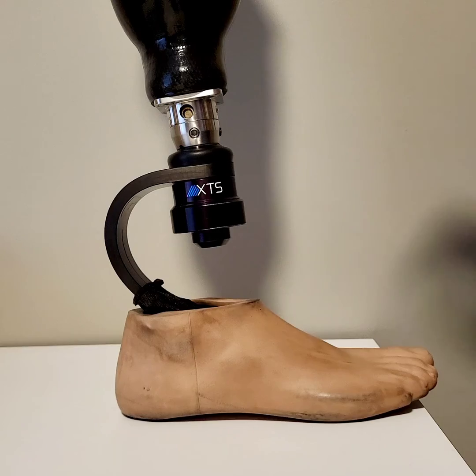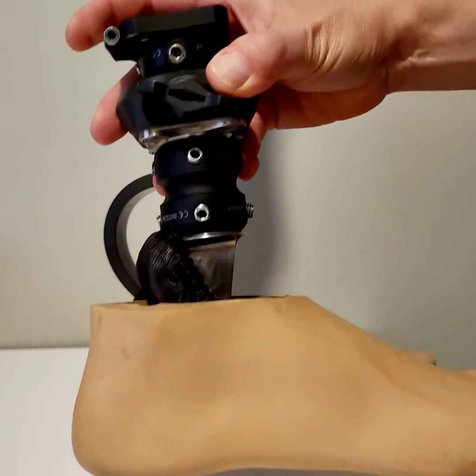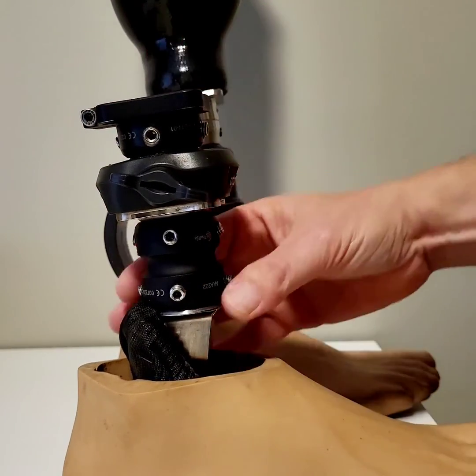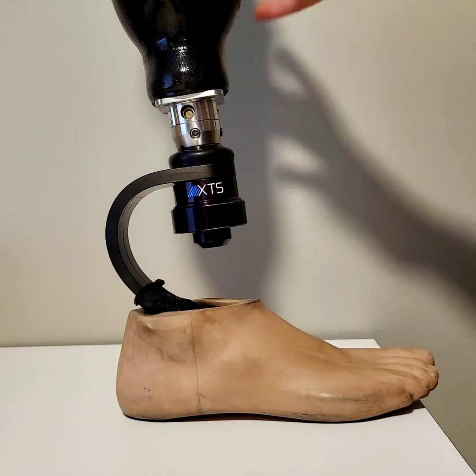This is why if you're a new amputee, they may start you off with a relatively low activity foot. That'll help them get all the height adjustments and angles set as your limb changes and as your walking improves.